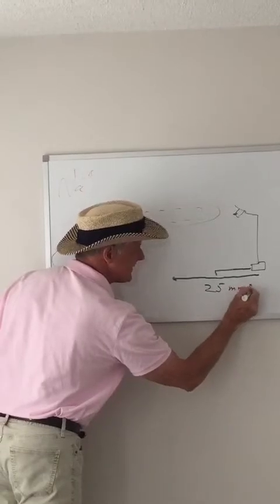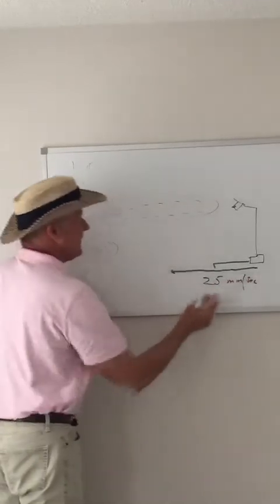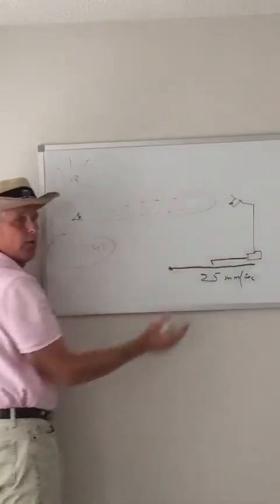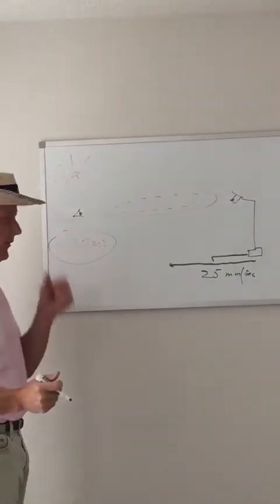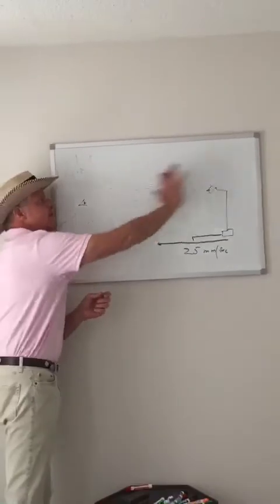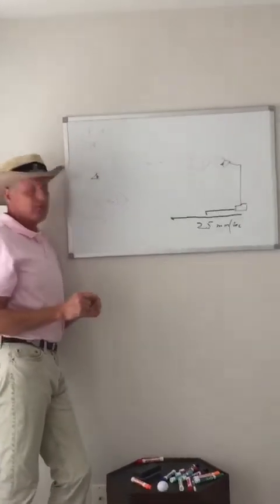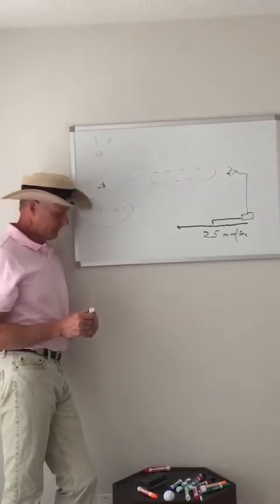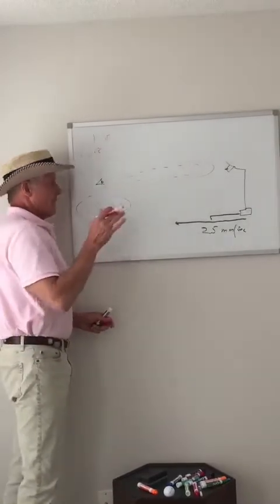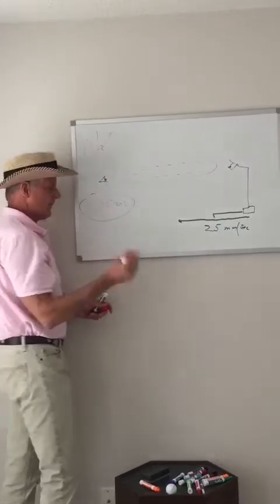Now, why am I telling you that? Because you have to know it. All right, I won't tell you anything you don't have to know. So this stylus sits here. It's hooked up to the transducer, hooked up to an eyeball, which is an EKG lead, just one of the 12 on a 12-lead EKG system, sitting there scanning this piece of heart muscle, or the entire heart, and it's waiting for something to happen. It's waiting for a depolarization process. So whoever constructed the EKG machine put several eyeballs around the heart, scanning it to see when it depolarized.